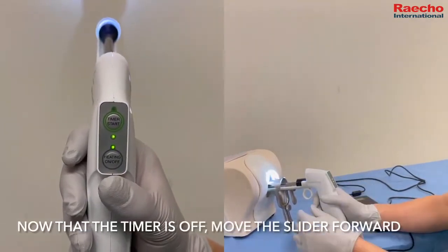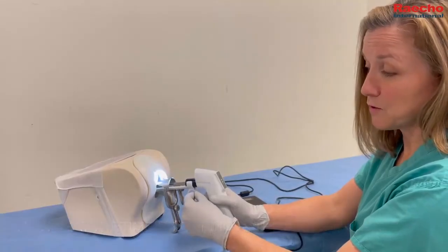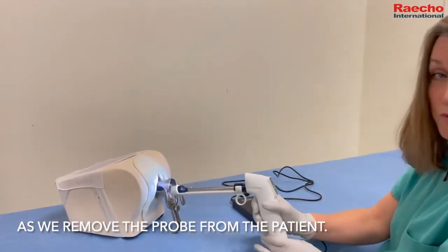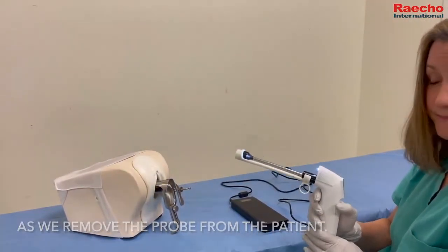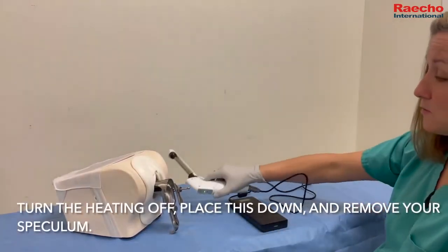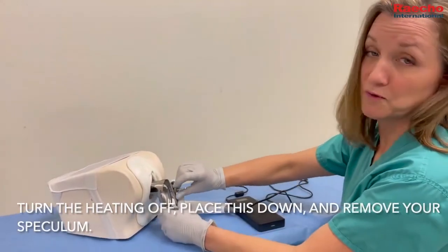Now that the timer is off, move the slider forward to protect the vaginal walls as you remove the probe from the patient. Turn the heating off, place the device down, and remove the speculum.